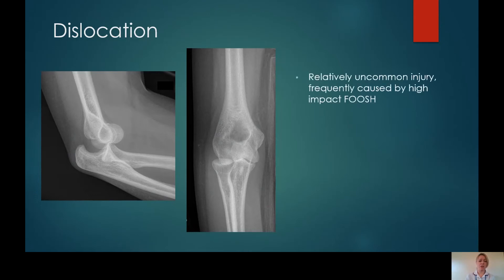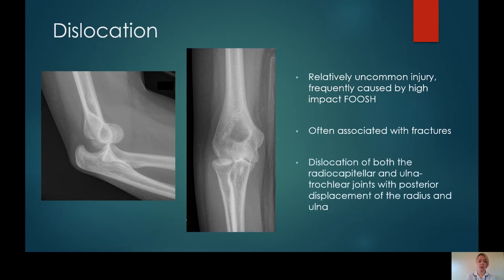Dislocations are another kind of injury that you may see coming through A&E. They are less common than a fracture, although they also frequently occur alongside a fracture, where there has been a bony impact when the joint has become disrupted. Frequently caused by high-impact FOOSH injuries, and there will probably be a joint effusion present, although they can be quite obvious. If you use your radial capitella line, you will see that the radial head does not transect through the capitellum. This is an example of a dislocation of both the radiocapitellar and ulnotrochlear joints, with the forearm displaced posteriorly, the proximal radius and ulna.